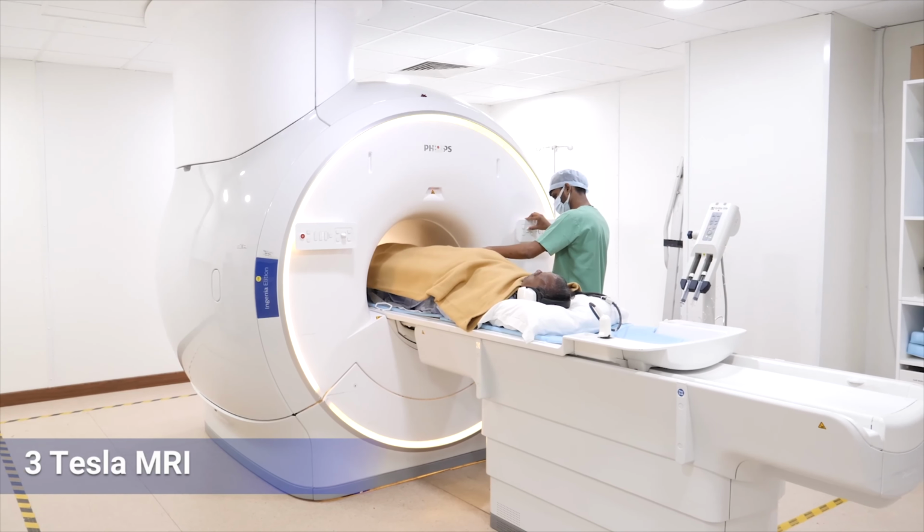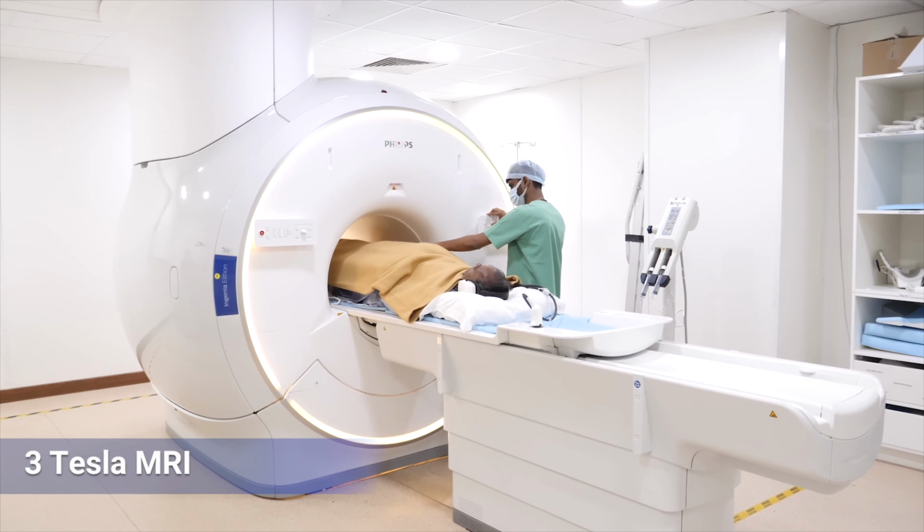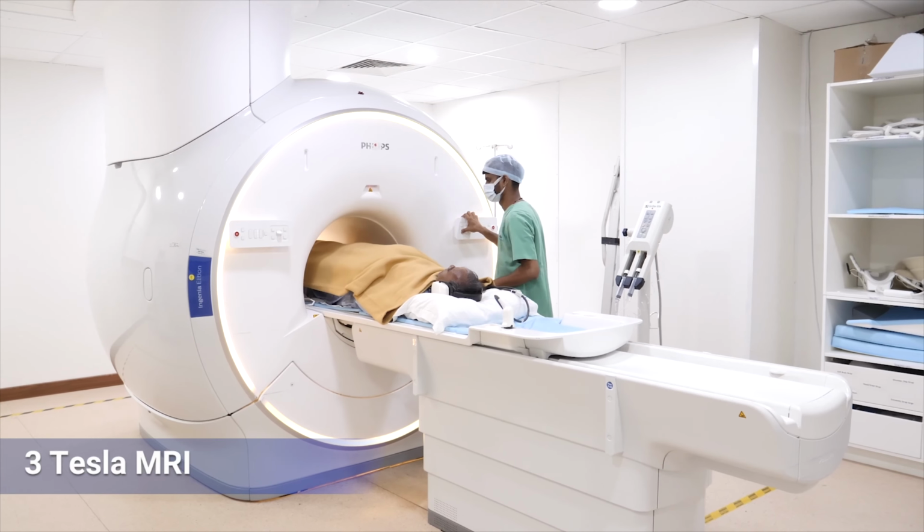It takes almost 30 minutes. Even for me or you, to stay still for 30 minutes is a challenge. So the younger the child, the more difficult it is. The third part is for those who have seen the MRI machine or even the CT machine. It's a big hollow machine. It's like a donut and you're put inside. And if you're awake and you open your eyes and look at it, it is terrifying.